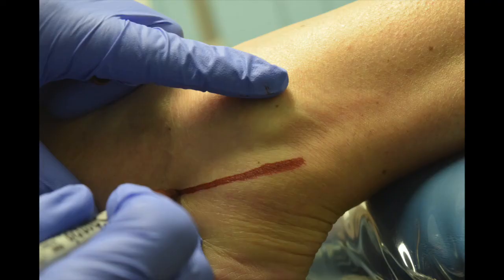I'm going to show you a decompression technique — it's kind of an older technique, it's a simple surgery, but it is a very effective surgery for certain patients like the patient we're going to show you today. The first thing we need to do before we take do the technique is map out exactly where we need to go. We're going to go to the lateral aspect of the heel in this surgery, so we map out the sural nerve to make sure we know exactly anatomically where that nerve is.